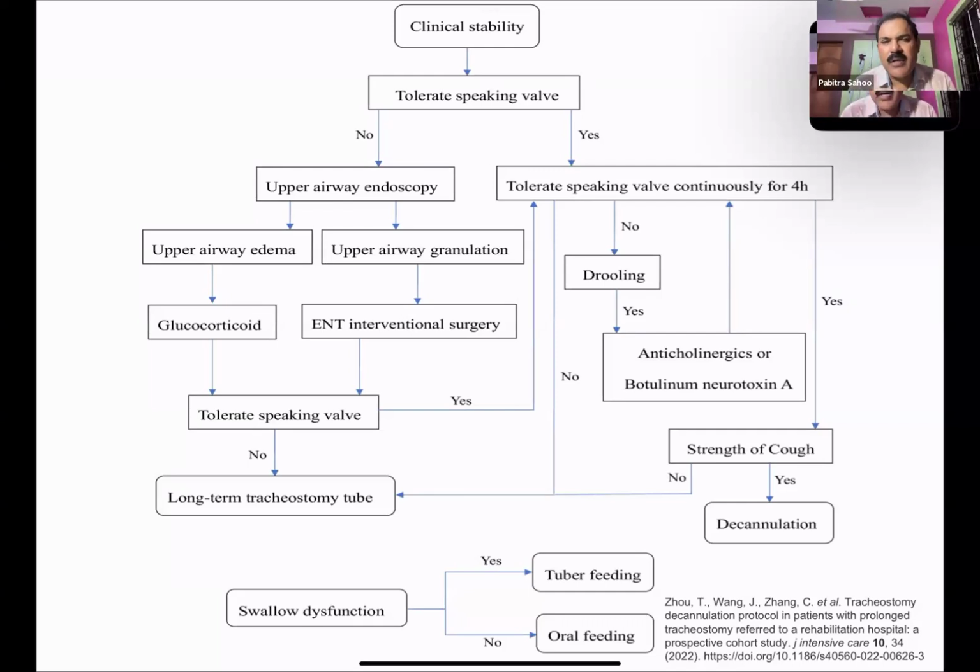Does it have to be calculated? It is displayed on the monitor, sir. The maximum FiO2 you can set is 100, and the minimum in the ventilator is 21. We keep the FiO2 at the level where the saturation is more than 95%. That will be the patient's FiO2.